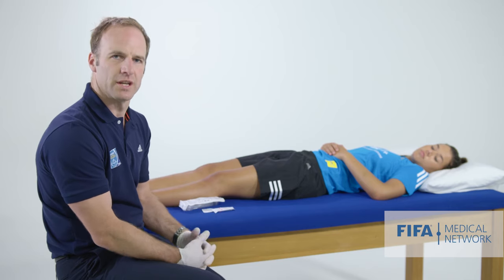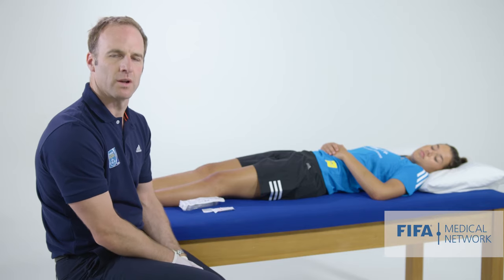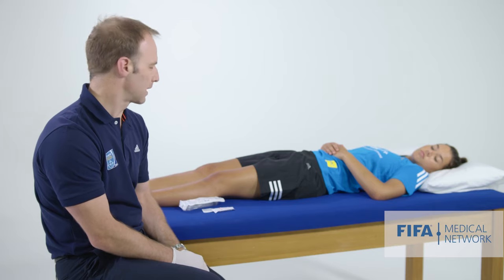For example, if they've injured their anterior cruciate ligament and the knee is tense and swollen, it's extremely painful. By aspirating some blood out of the knee, it can make it feel a lot better.